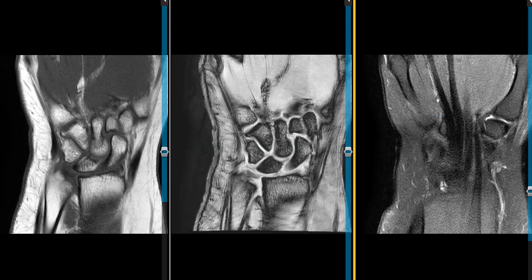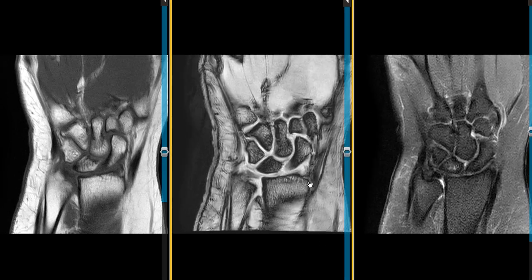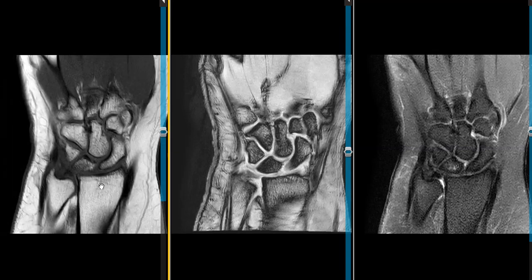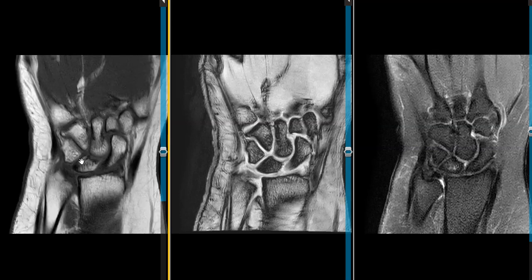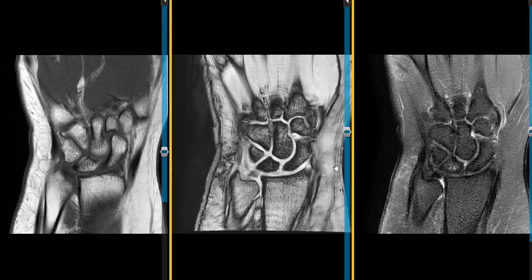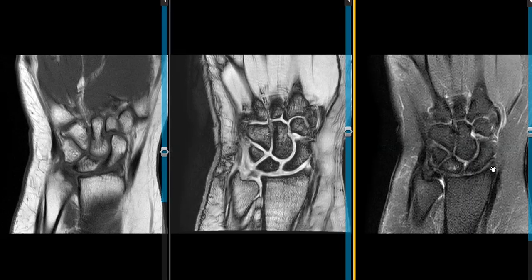We're going to look at that more closely. We have three sequences. This is called a T1-weighted sequence, and marrow should be bright. We see, for example, the distal radius is really bright, the ulna is bright — they look fantastic. But we see again that the lunate bone is a little bit different than the other ones. There's a little dark spot over here in the corner which is not normal. If we look on this view over here, this is a fat-suppressed proton density sequence — marrow should be nice and homogeneous.